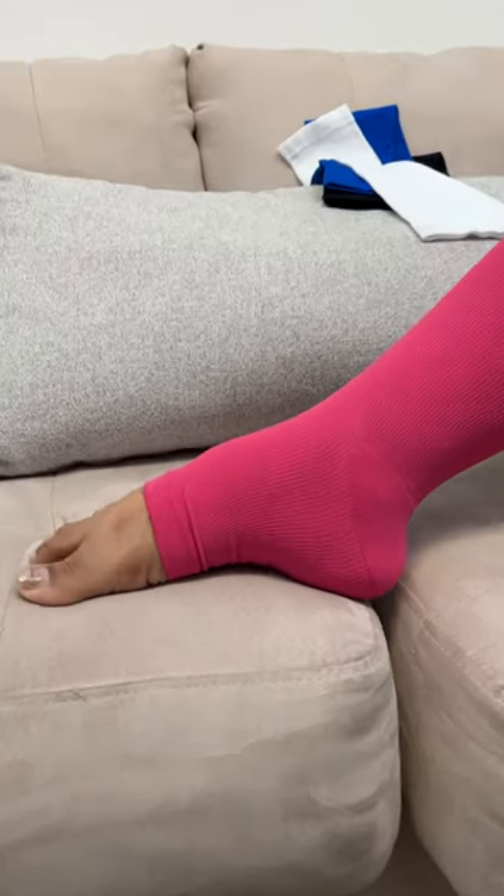They're easy to put on and take off. I love that they're toeless so I can walk barefoot in them and not have to worry about getting sweaty, uncomfortable feet, but I still have some cushioning on the heel.